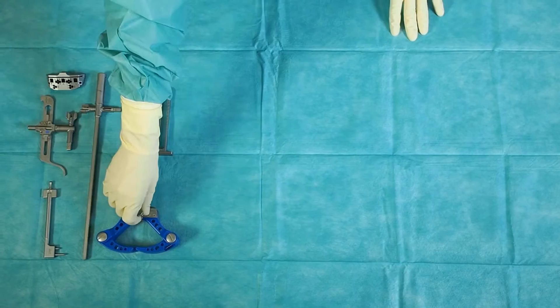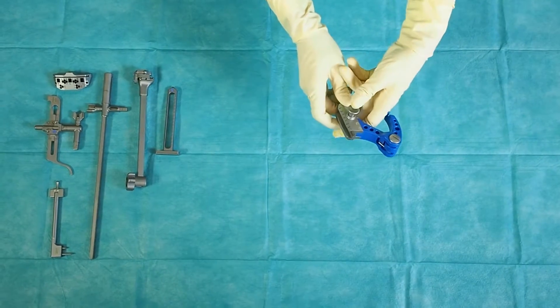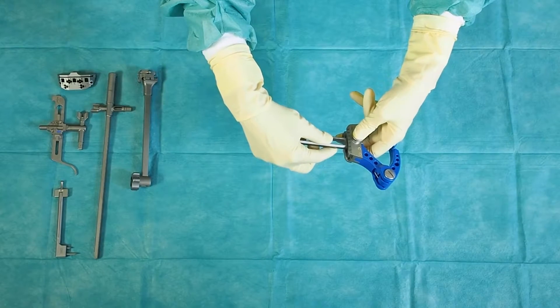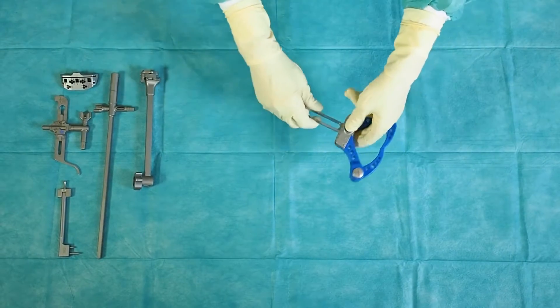Press the upper button on the bimalleolar clamp. Engage the support in the groove. When the neutral position is reached, release the button.